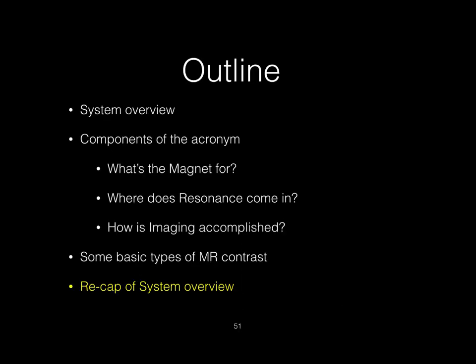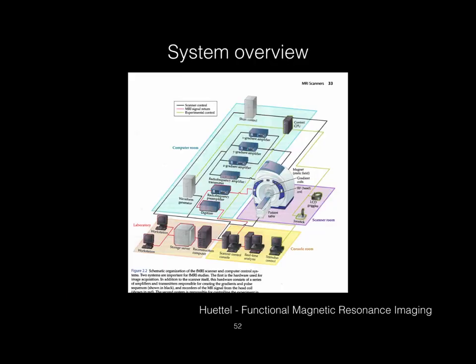Okay. So finally, we have our magnet that essentially generates our signal, or a little bit of magnetization. We have our RF system here that we transmit energy into our system and then detect with.